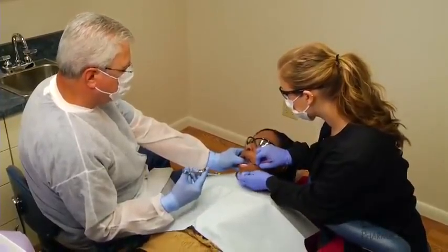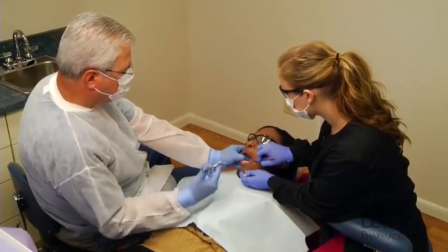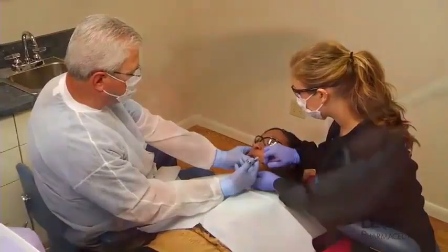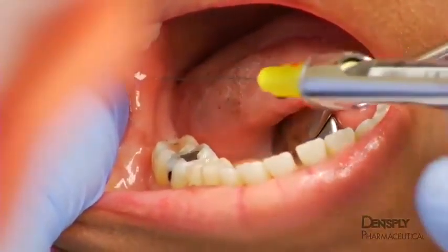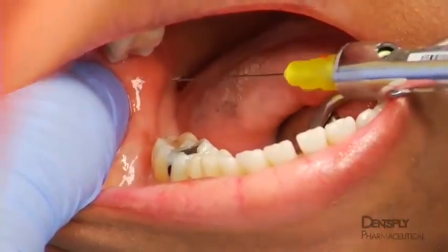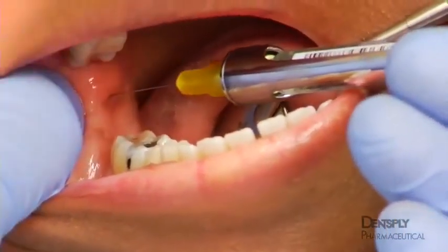retracting the cheek and the buccal pad until it rests within the greatest depression of the coronoid notch and is made parallel to the mandibular occlusal plane. With the syringe oriented over the opposite premolars, the needle is advanced to the insertion point lateral to the pterygomandibular raphe and at the height of an imaginary line bisecting the thumbnail.